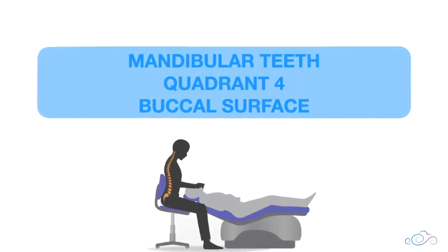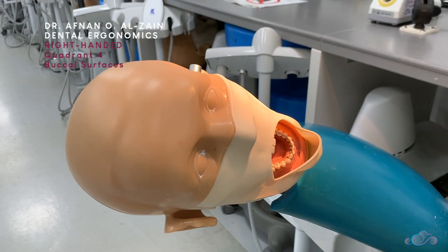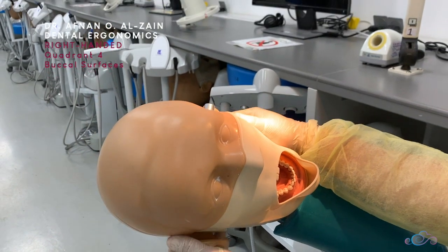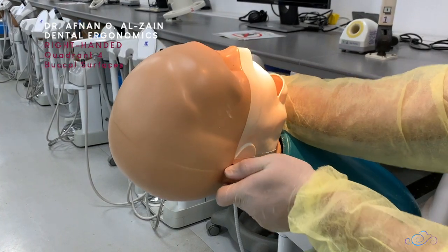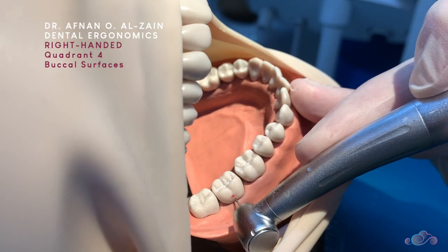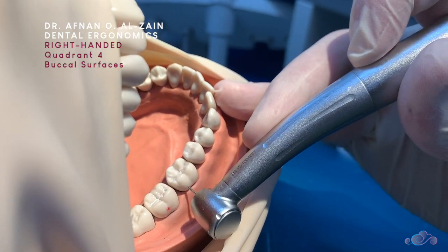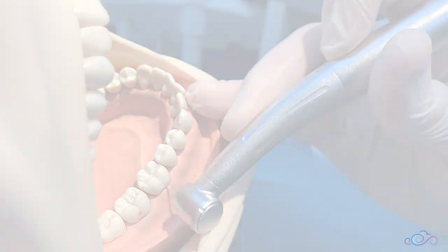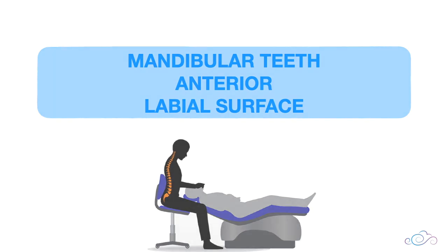Moving to the buccal surfaces of quadrant four. When working on the buccal surfaces of quadrant four, you're going to tilt the dummy head a little bit until you can see directly. Retract the cheek and make sure the burr is perpendicular to the surface.